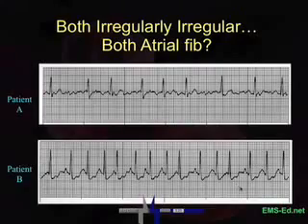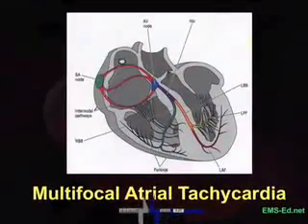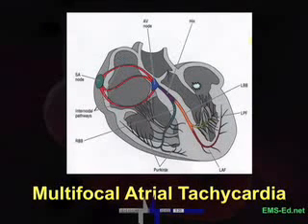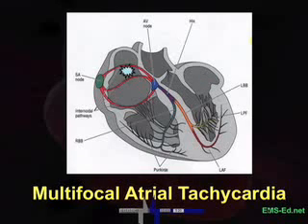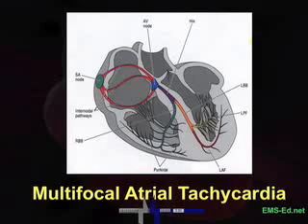What is going on here? The pacemaker is wandering all over the place. If the rate is less than 100, this is called a wandering atrial pacemaker. When the rate is over 100, we call it multifocal atrial tachycardia, or MAT.